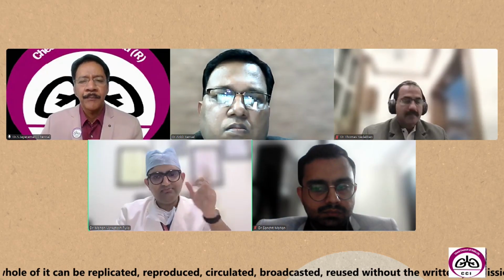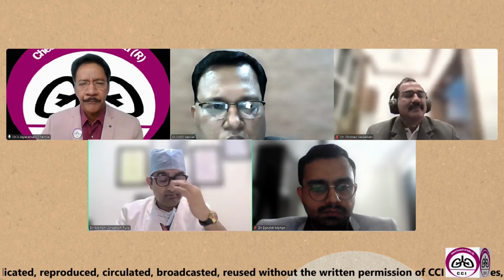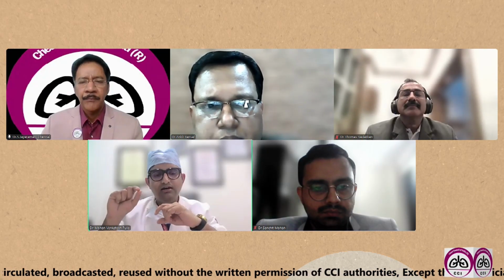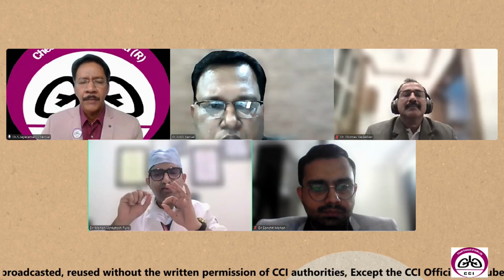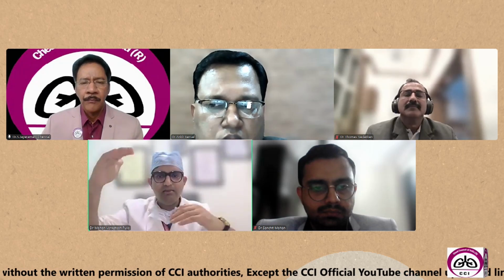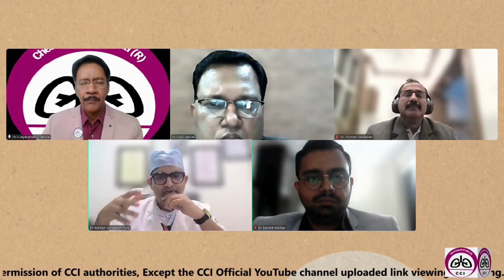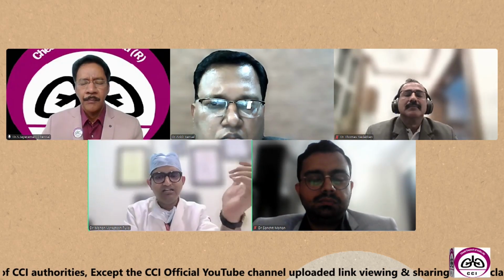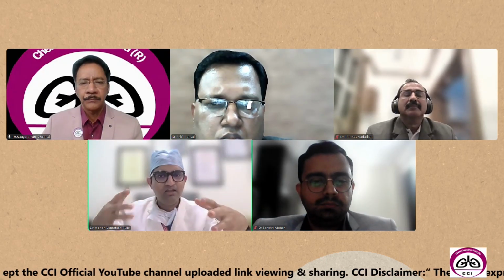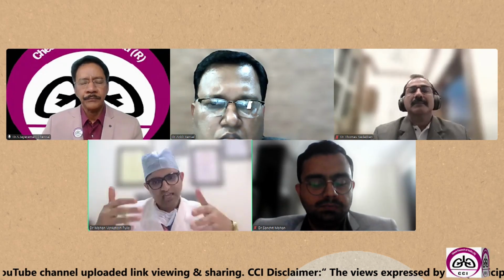So I'm training the juniors, because if you compare mediastinoscopy as a technique, as a surgery, the margin of error is very, very less in mediastinoscopy, because the lymph nodes are surrounded by the main pulmonary artery, SVC, aorta on one side, and the brachiocephalic artery. So if bleeding happens, which I have seen with my own eyes, you can injure all possible vessels that have been described before, starting from SVC, azygos vein. We have injured ourselves. Whatever vessel you mentioned there, everything we have injured.